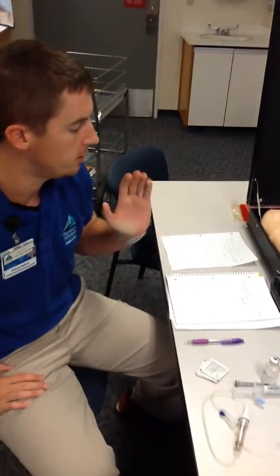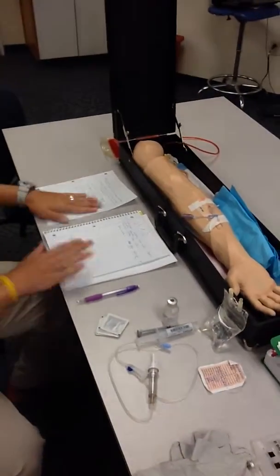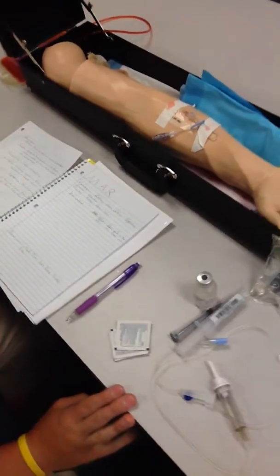I'm Tony Rayburn. I'm with FSCJ, the nursing program, in second term, and I am going to demonstrate the preparation and administration of a Minibag. I've come to my med room. I have my MAR for my client. I'm going to administer vancomycin today to this client.